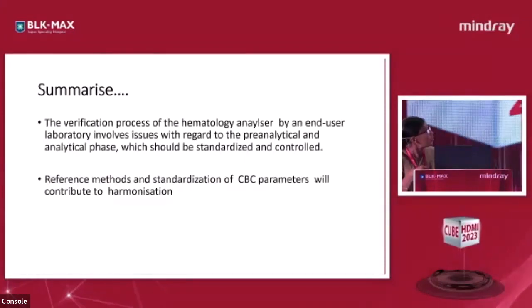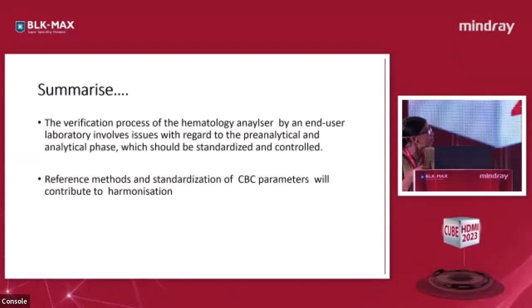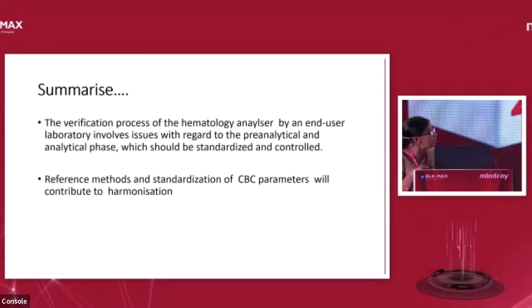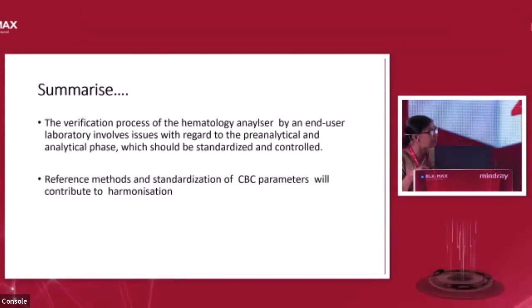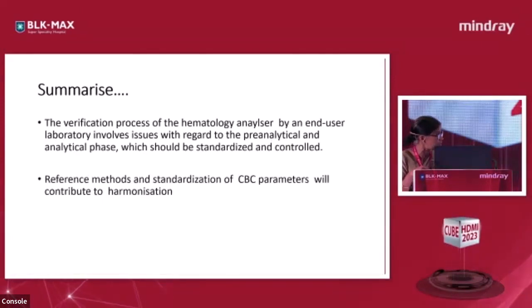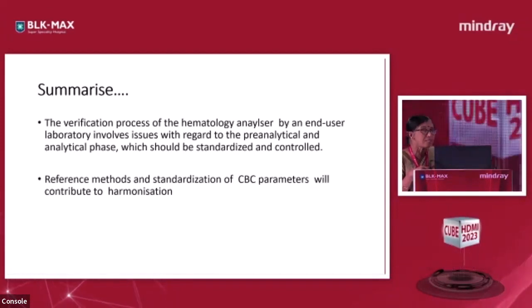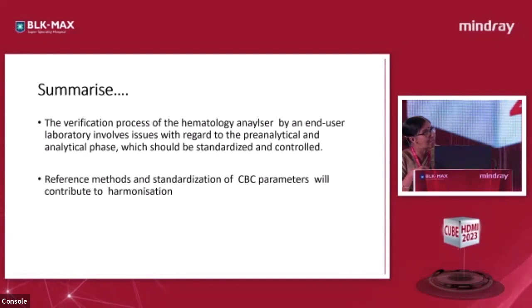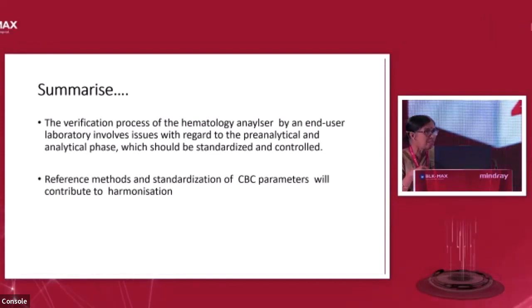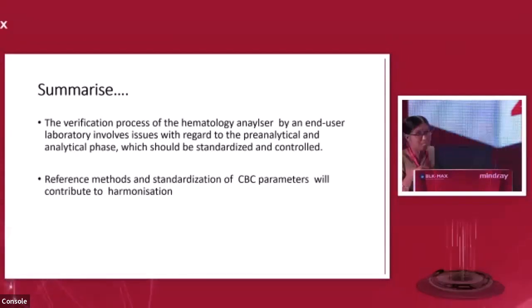contributing to the variation. So to summarize, the verification process of a hematology analyzer by an end-user laboratory involves issues with regard to the pre-analytical and analytical phase, which should be standardized and controlled. Reference methods and standardization of CBC parameters will contribute to harmonization and more reliability on the results generated by the auto analyzers for clinical practice. With this, I conclude the session.